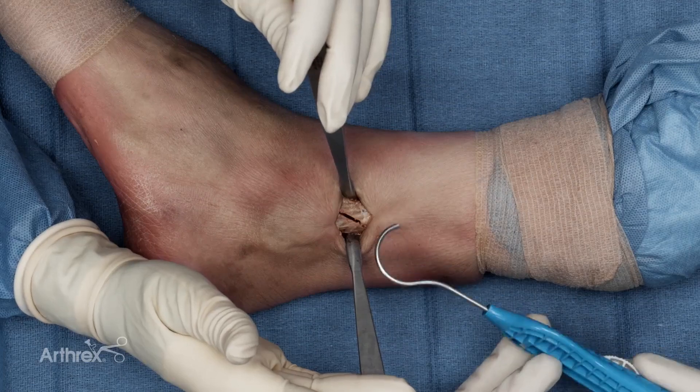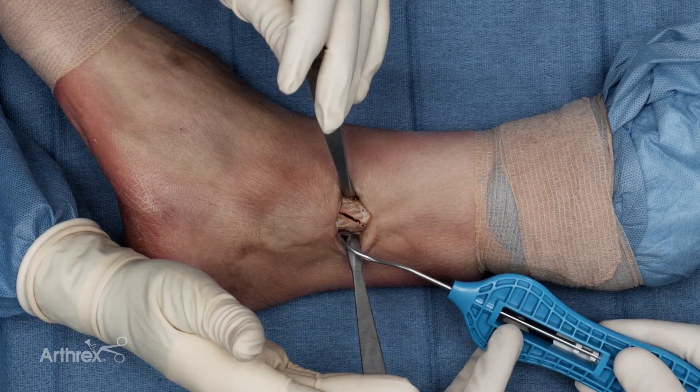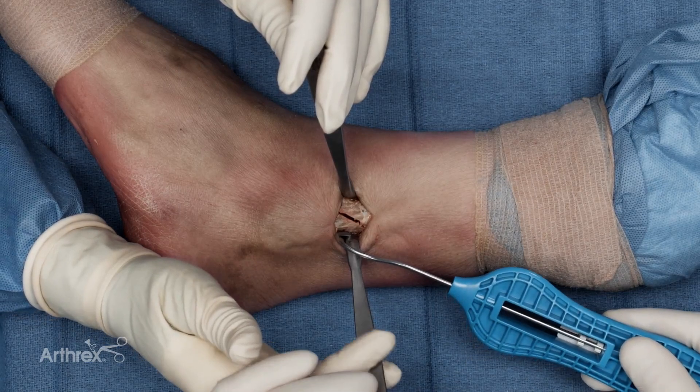To facilitate passage, I like to pass the fiber tape cerclage passer from posterior to anterior, allowing me to not get into the peroneal tendons.